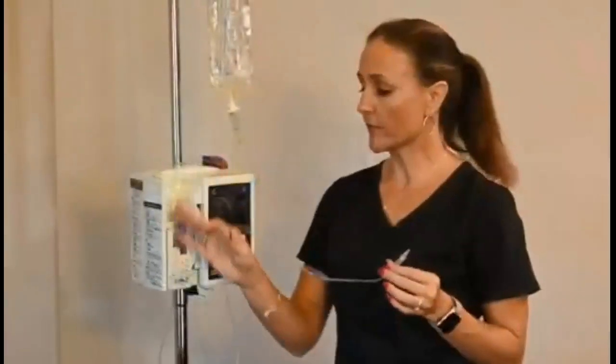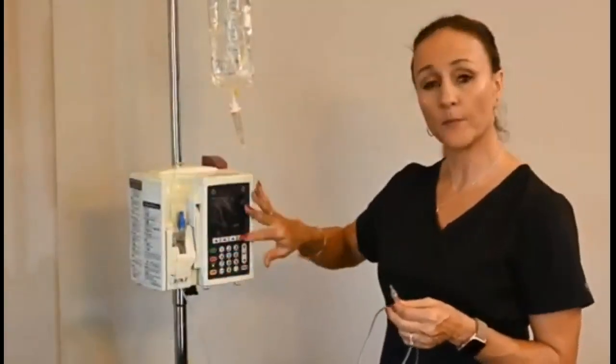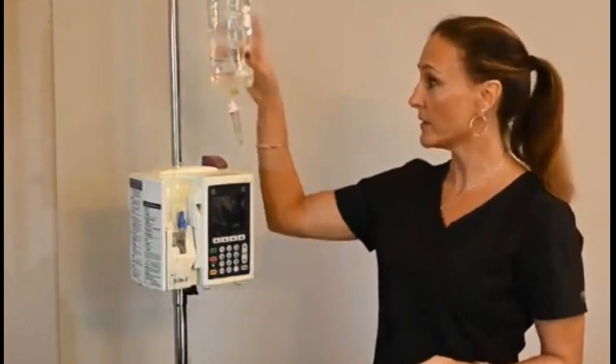Once I put it into the pump, I can get my pump and program it, but not started yet. I would go to my patient. If I haven't already made sure that I have flushed the patient's IV to make sure that it's patent, I would do that at this time. Again, I would have gloves on, and then I would come and connect this to the patient, program my pump, and start it. That is primary IV bag and primary tubing.